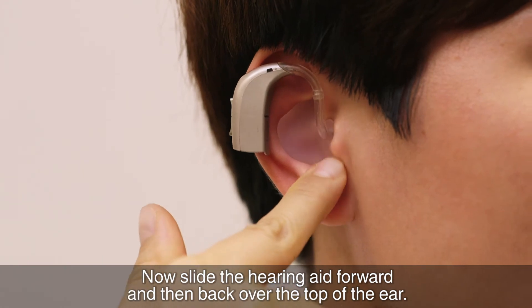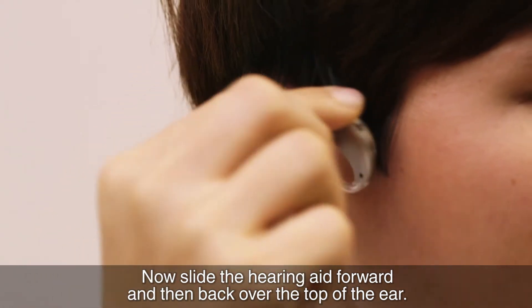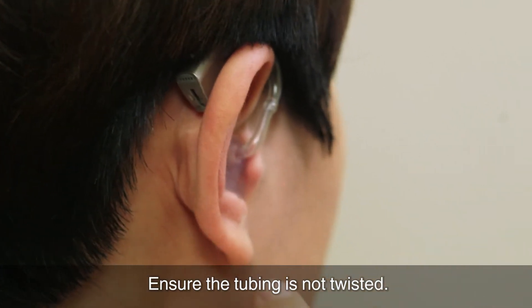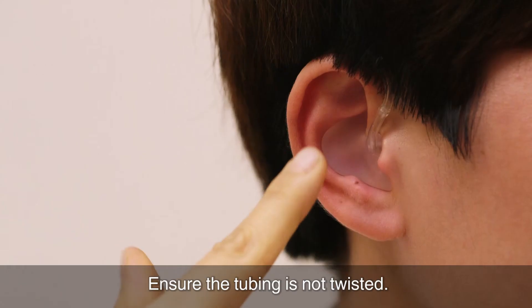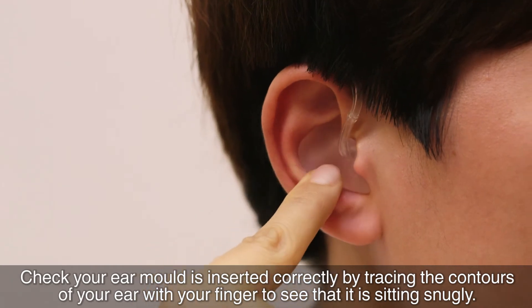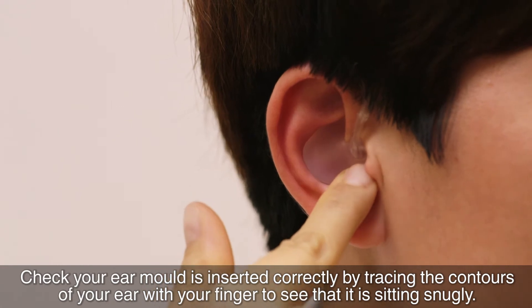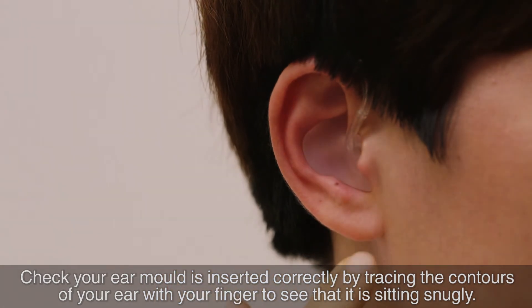Now, slide the hearing aid forward and then back over the top of the ear. Ensure the tubing is not twisted. Check your ear mould is inserted correctly by tracing the contours of your ear with your finger to see that it is sitting snugly.